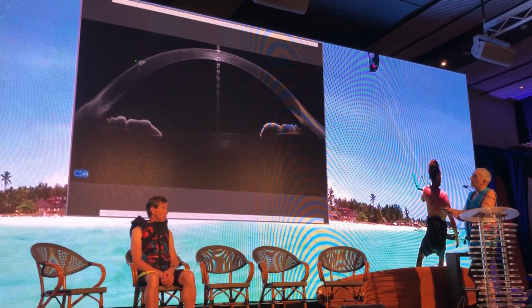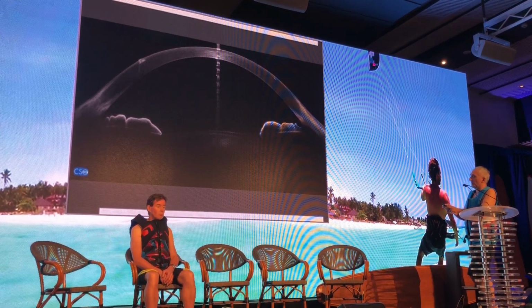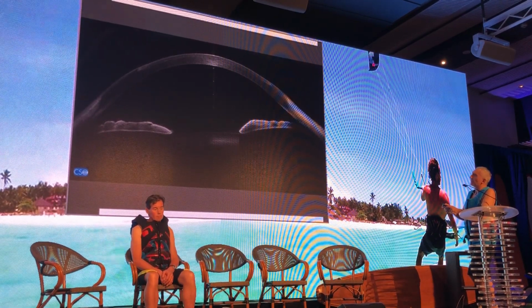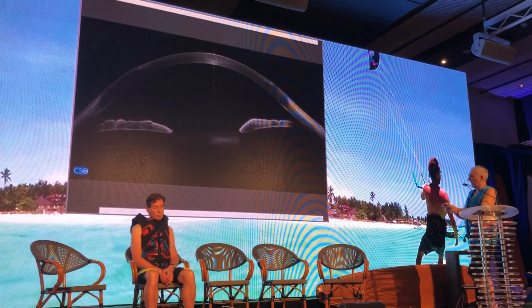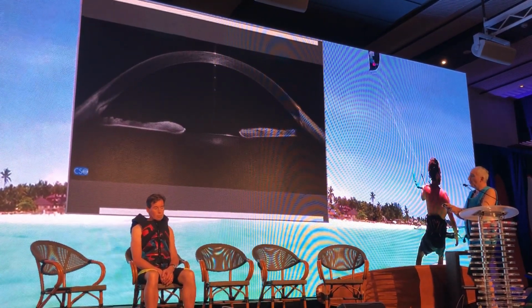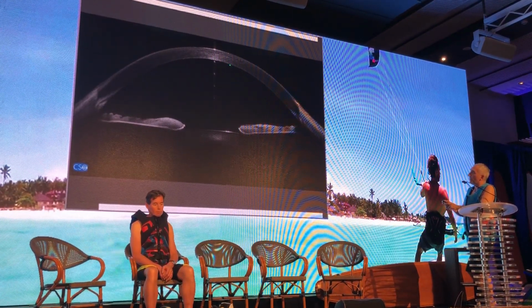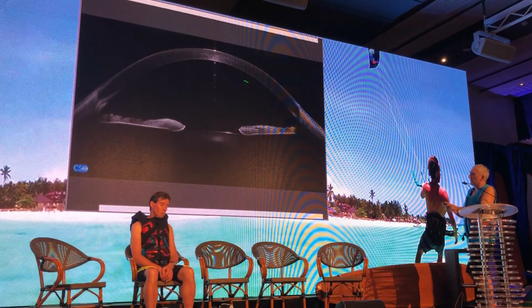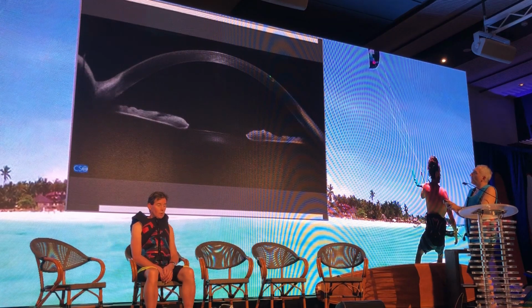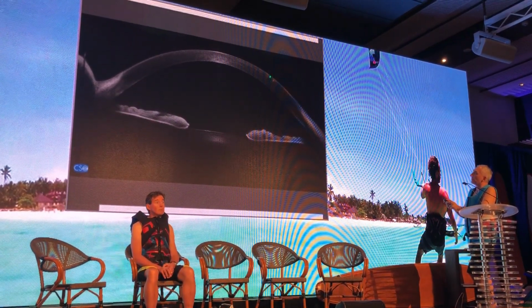This is a little ingrowth after LASIK, otherwise the interface is beautiful. And this is after hyperopic LASIK. Again, the interface is fantastic, but it's not always like that. This is a beautiful interface. This is a patient after a SMILE. You can hardly see anything here. But if we go to 135 degrees, where I enter to take out the lenticule, then you can see the entrance side.